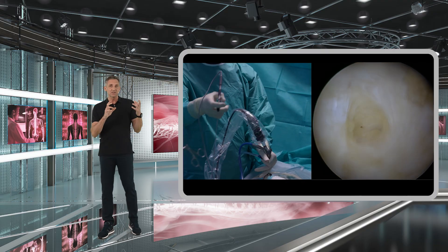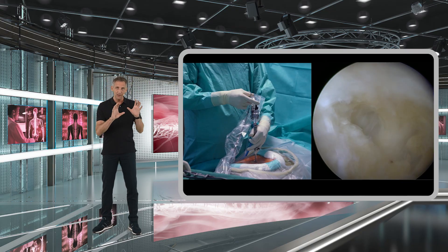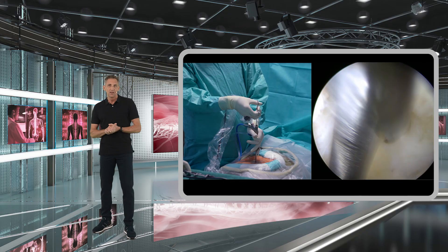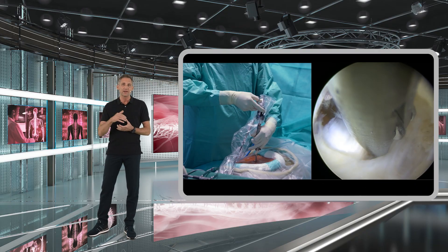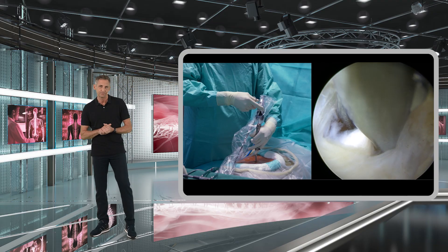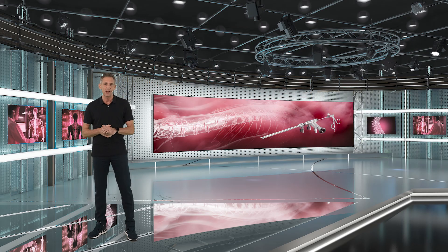This step using the scissors is repeated several times until the yellow ligament is gradually thinned out and until you can carefully go through the last and final layer of the yellow ligament, which will then open the access into the spinal canal.